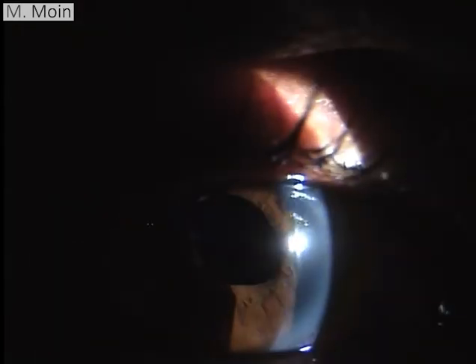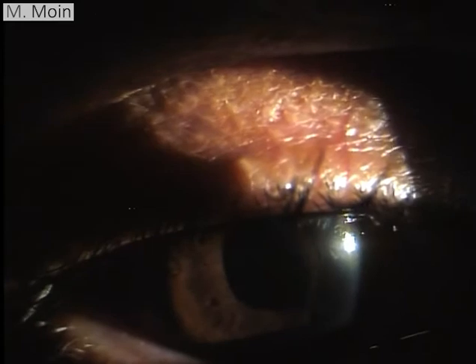What you're seeing here is the patient was a pseudophakic patient. Then we go backwards and see where actually the tube is coming from all the way. The pupil is slightly oval or irregular.